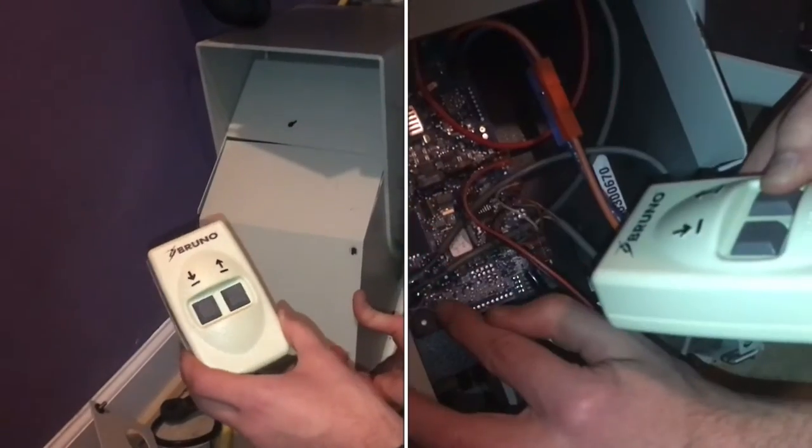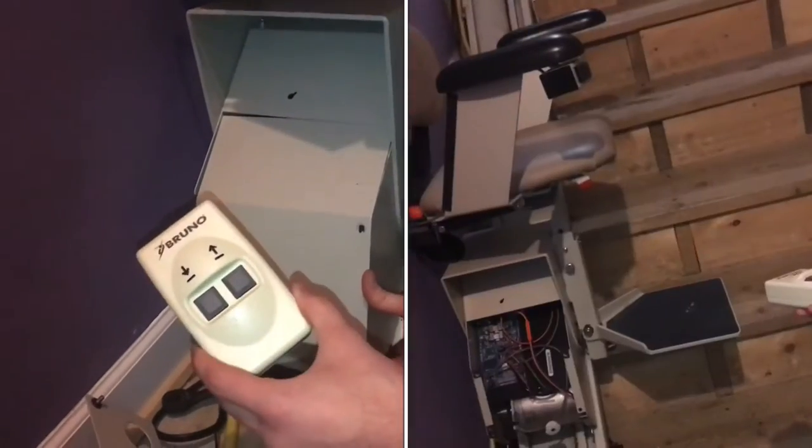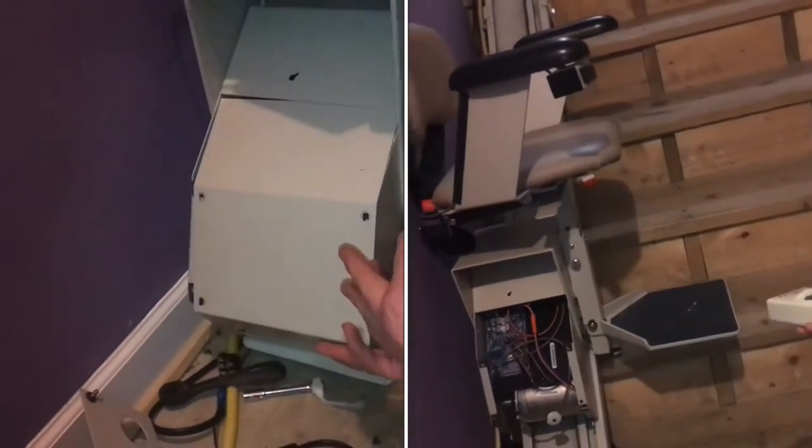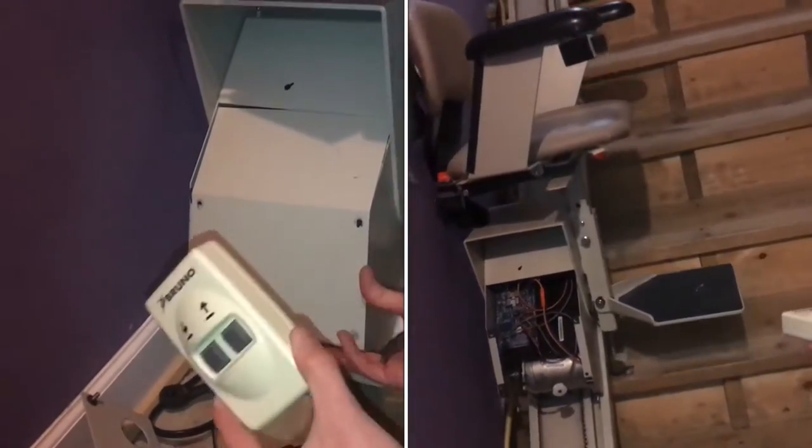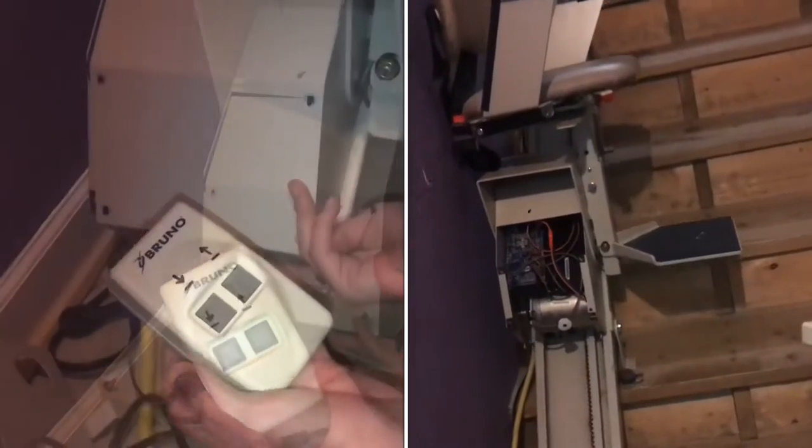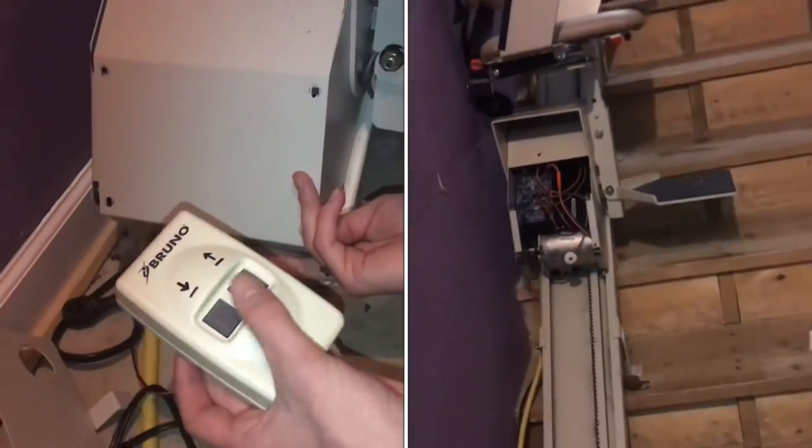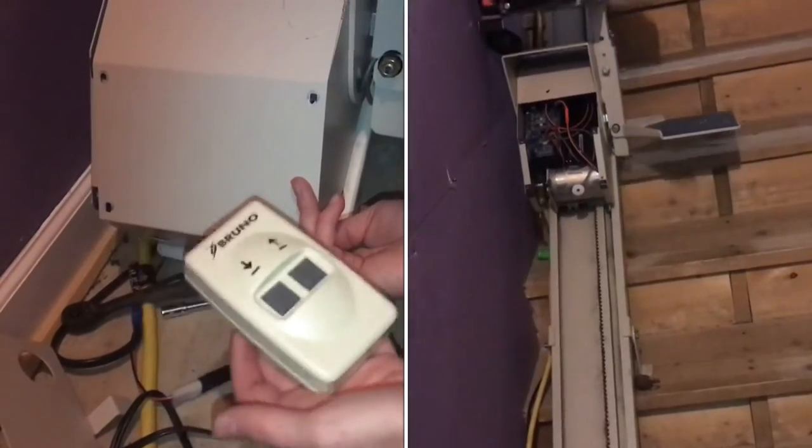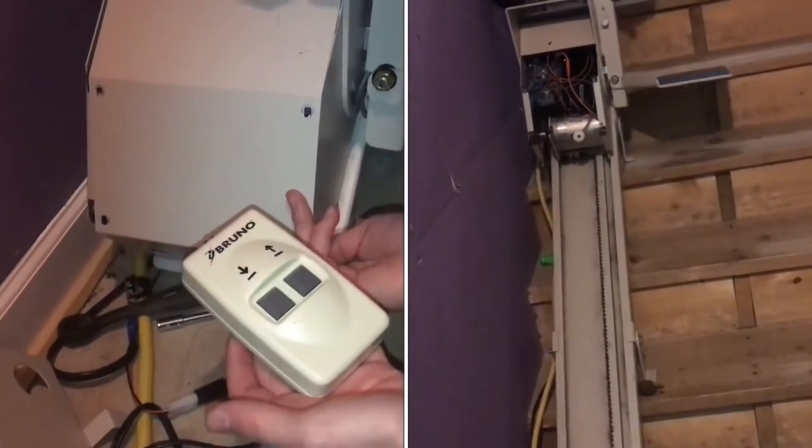I'll show you how to reconnect a Bruno remote on one of these Bruno stair lifts. It's pretty simple. If your remote isn't working at all when you hit the buttons and it doesn't move, we're going to start by taking off this back plate.